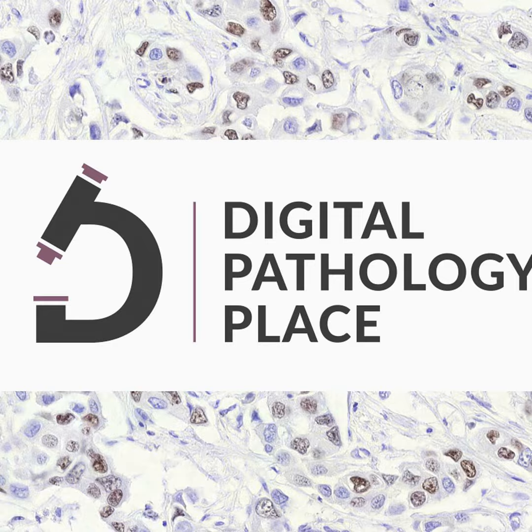There is a non-inferiority margin of minus 4% that seems to be consistent across different whole slide imaging systems throughout the industry. Where does it come from? Why are we so consistent? What are the numbers that you need to hit, in addition to how many cases you need to do for the statisticians?